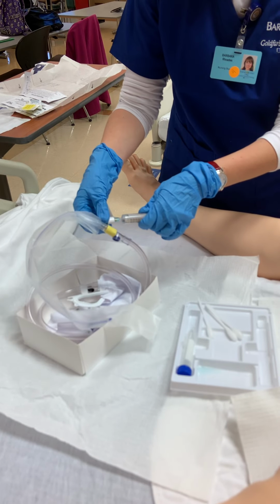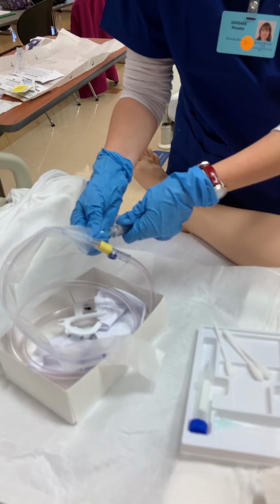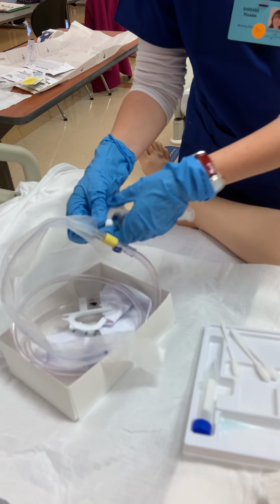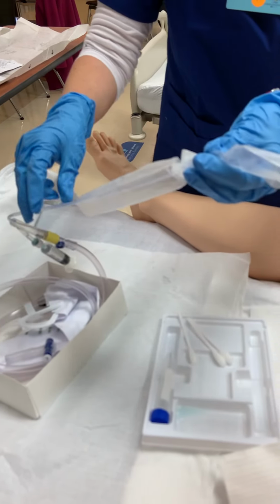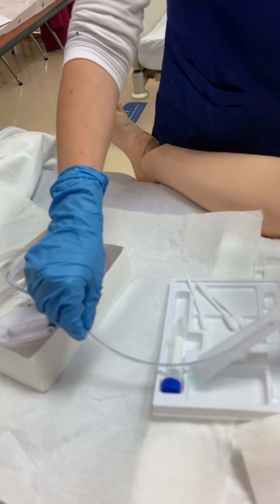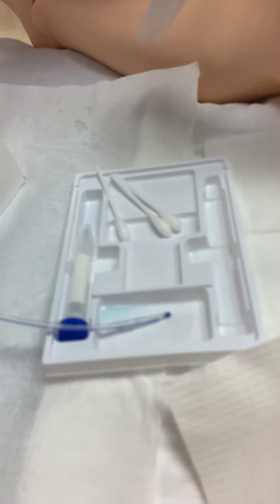Just get this ready for when we need it later. Hopefully it'll stay in there where it's supposed to. And I'm going to take this off, touching it minimally, so it can sit in the lubricant while I prepare everything else.